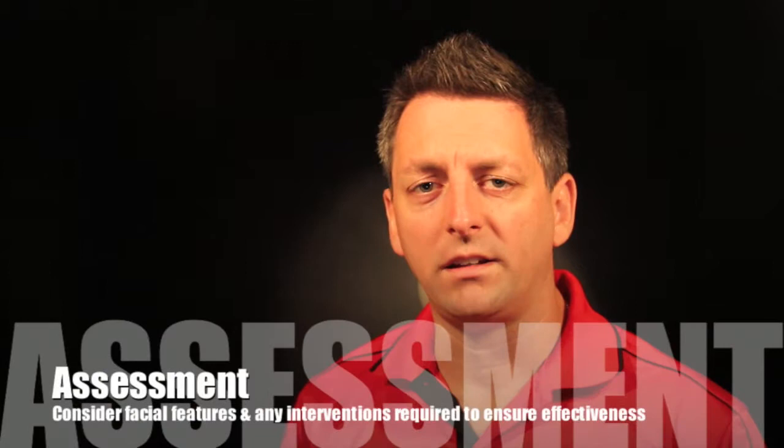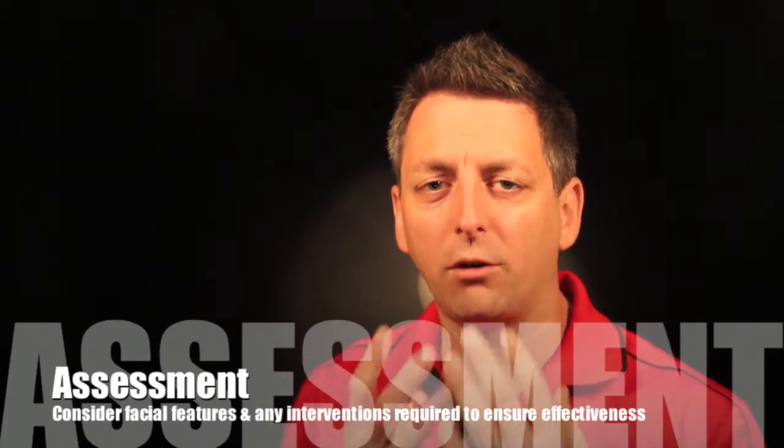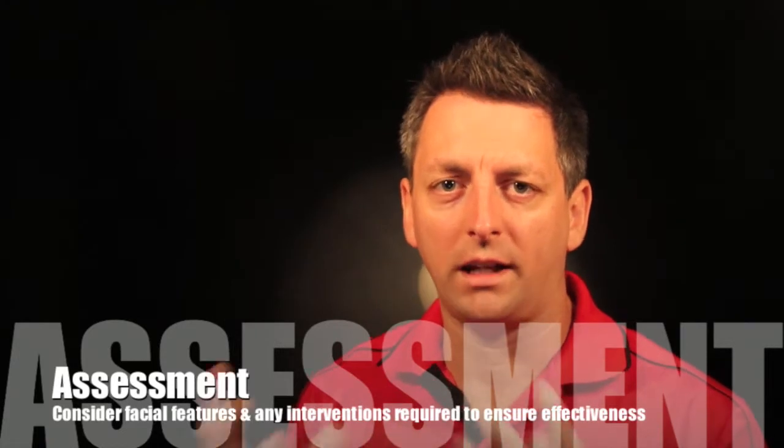Other things with assessment is look at the shape of their face and the skin around their face. Will they take a mask on? Have they got a big beard that's going to create a lot of air leaks? So we've got to take all these factors into consideration. Can you sit the patient bolt upright so they get the best lung expansion? Or is something impeding them, so they have to be lying further back?